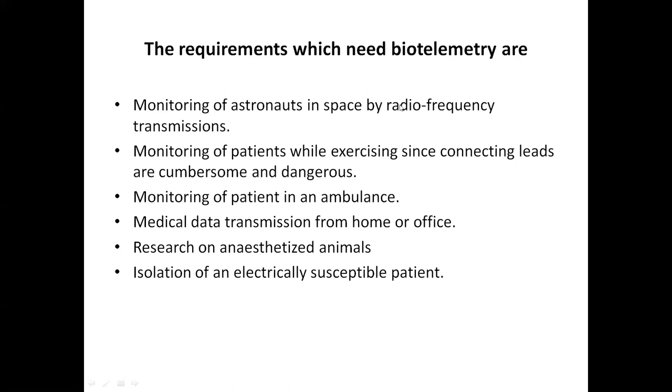Sometimes we require a patient ambulance system. When a patient is traveling in the ambulance, we have to know the status of the patient, whether he is alive or not. That can be done by biotelemetry. In foreign countries, medical data transmission from home or office can easily be done using biotelemetry.